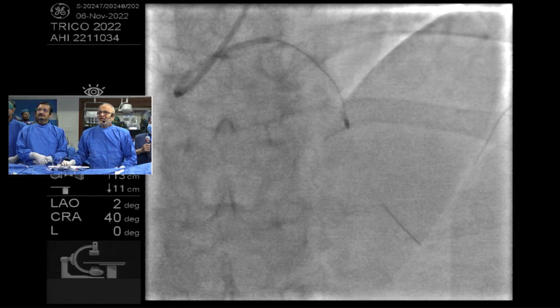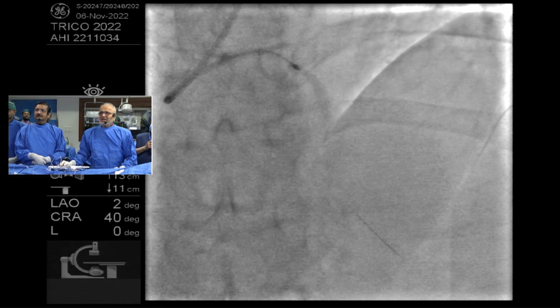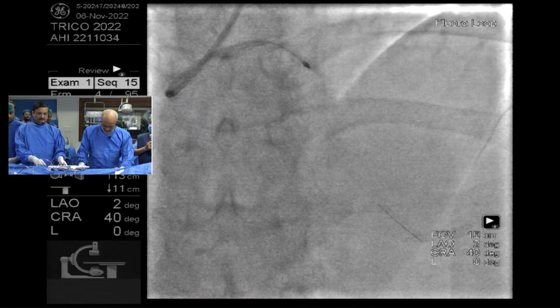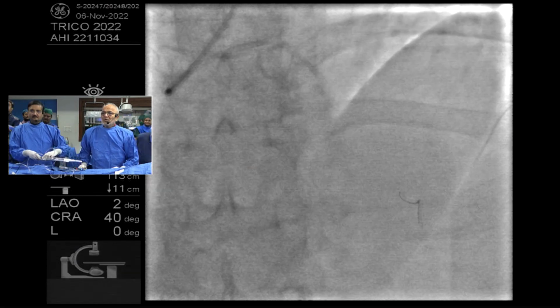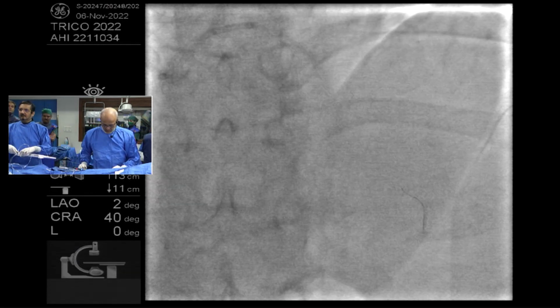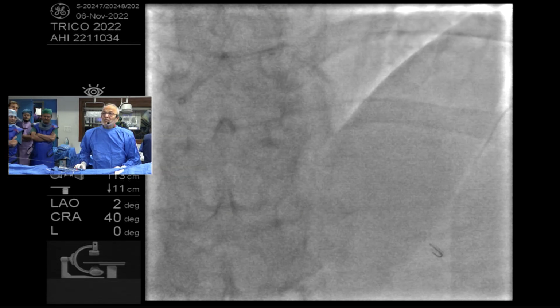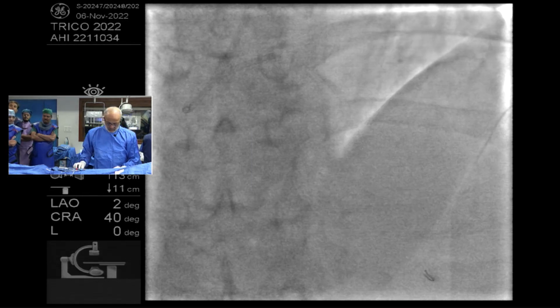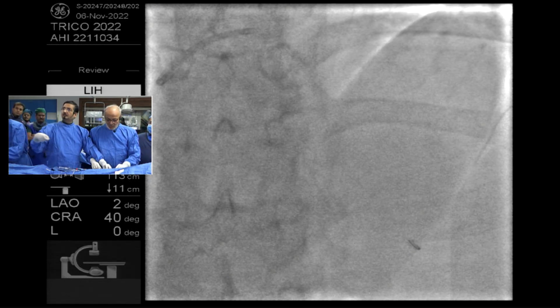Now there is hypotension. Polishing run. Okay, I think we are done. Dynaglide on, and quickly we come out. There might be some no reflow. Are there any ST changes? No. Oh, good. I can see a good normal T wave.